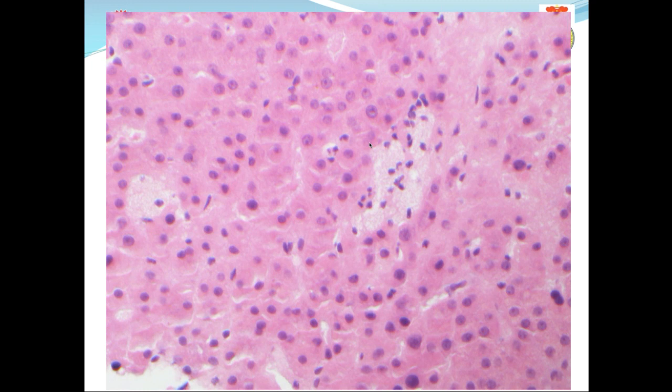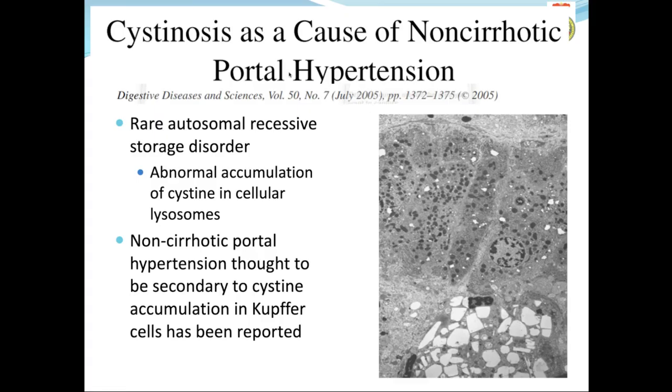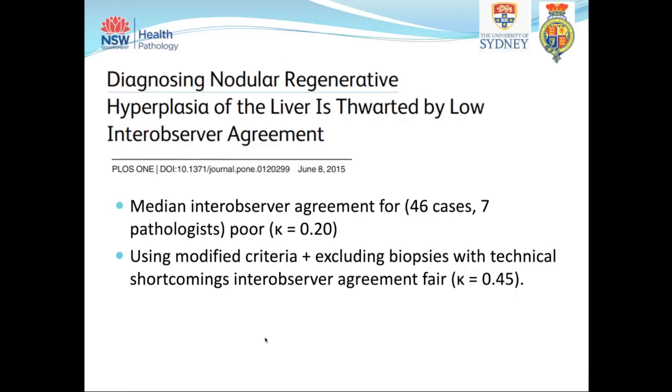Looking more closely in the sinusoids, they were packed, many of them, with these Kupffer cells containing this finely granular material pictured again here. And this, in fact, is a case of cystinosis causing non-cirrhotic portal hypertension, which is one of the synonyms or terms used for nodular regenerative hyperplasia. And this pattern of injury is thought to be secondary to cystine accumulation in Kupffer cells blocking the sinusoids.